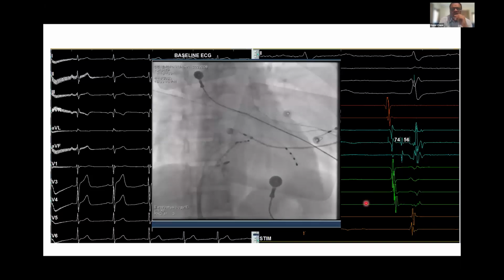So what do we do in the cath lab? We put catheters inside the heart. Here is one image from a slide, RAO view, showing a quadripolar catheter in the AV junction. We would expect the AV plane to be here. Assuming they have all gone up through the femoral vein, this catheter should reach the AV junction there.